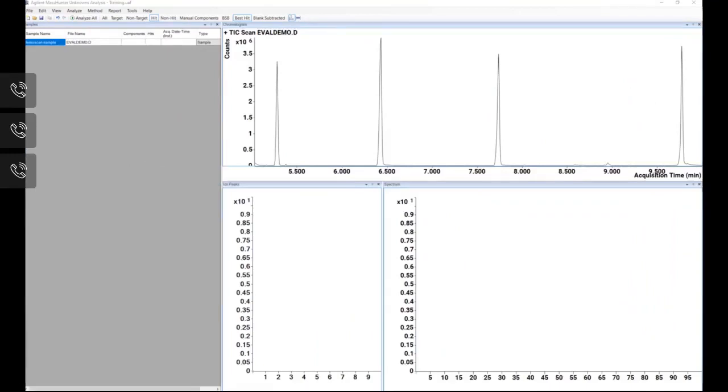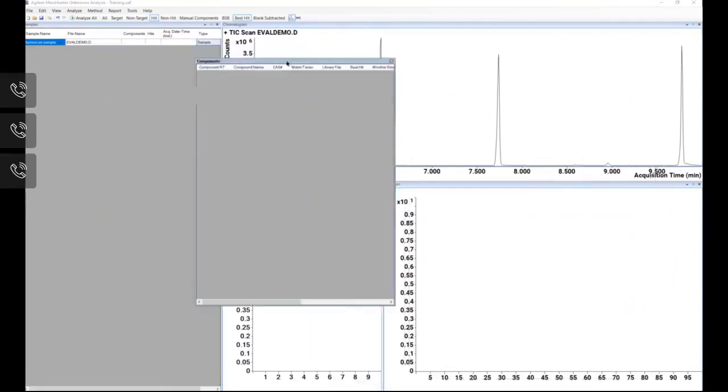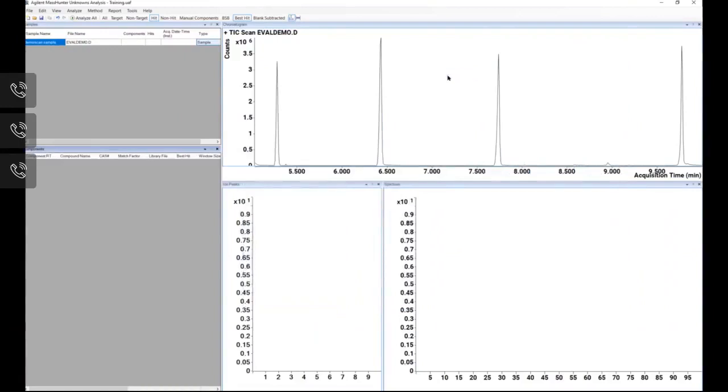Of course, mine puts it on another screen, but I'm going to drag it back in here and it goes into the middle of the screen. And then I can show you different parts and I can resize it and all kinds of stuff. So this is a nice way to get a picture of the screen that you want to see. It's a nice way to do presentations so that you don't have to move everything around. And if I want to go back to where the original window was, I can right click in the title bar and take the checkbox off and it goes back where it was.